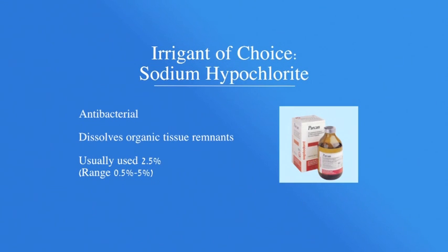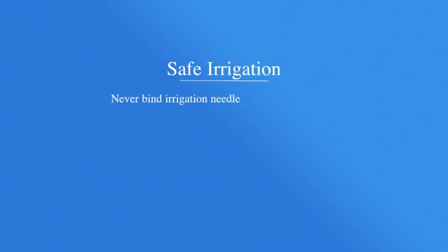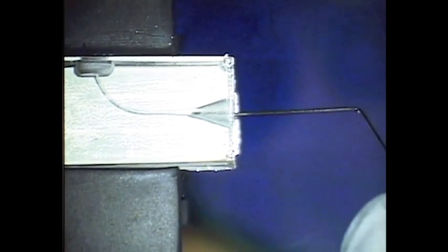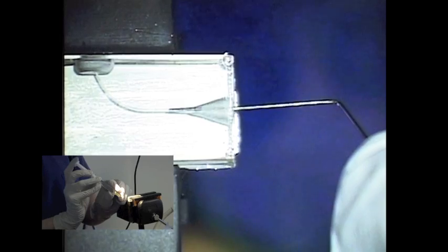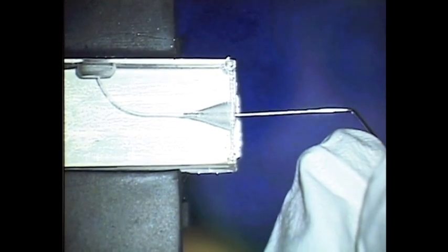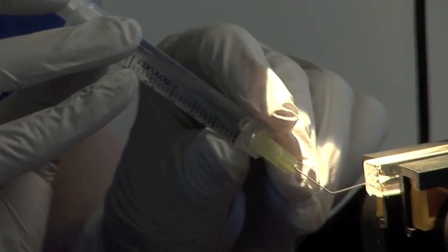It's important at this stage to also get some irrigation in. You can see here I'm using the syringe, and I would like you to use it with your finger — just really gentle pressure into the root canal, and it has to be a passive movement. You can see the irrigation needle going in here. You mustn't bind it, else you could cause a hypochlorite accident. Keep it out and then introduce some of the irrigant gently into the canal.